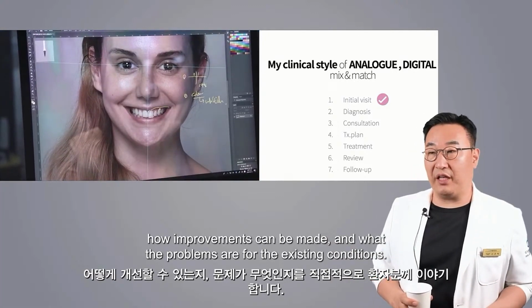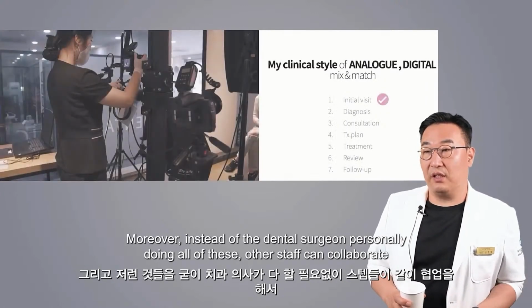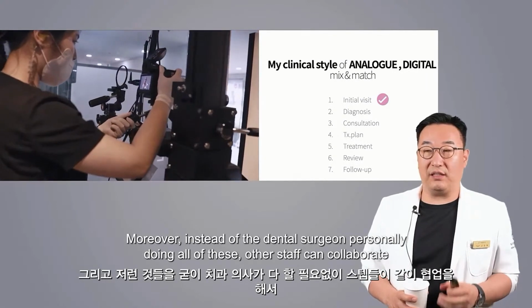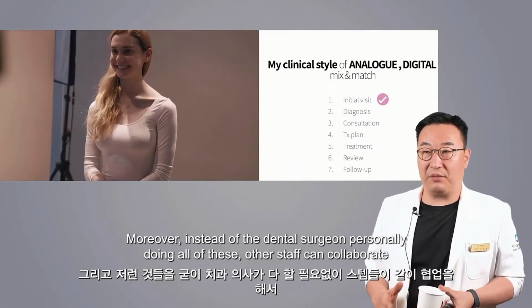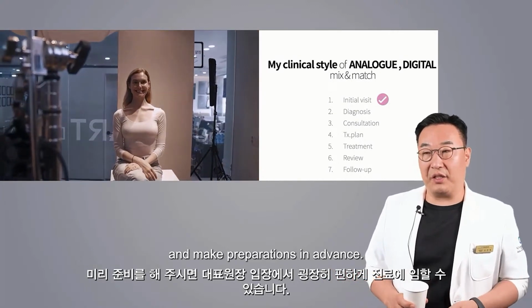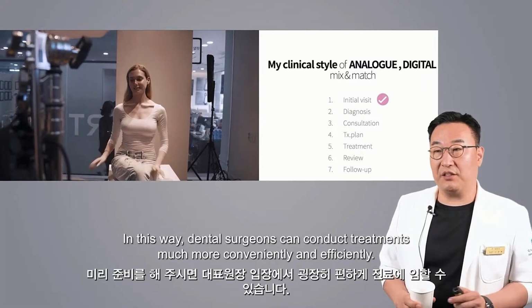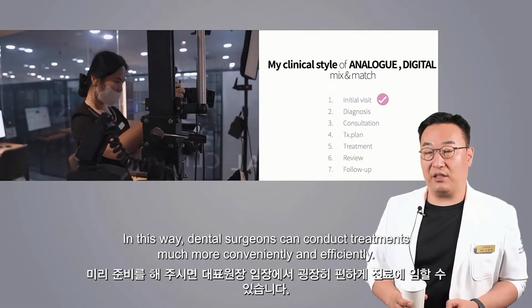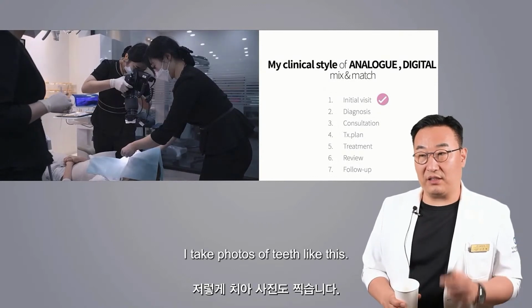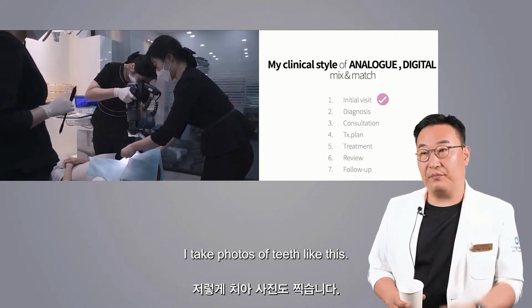Moreover, instead of the dental surgeon personally doing all of these, other staff can collaborate and make preparations in advance. In this way, dental surgeons can conduct treatments much more conveniently and efficiently. I take photos of teeth like this.